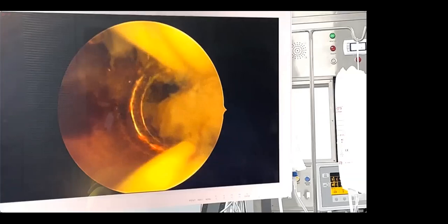And the other thing is there are bags that you actually put under the patient's buttocks, which collect all the fluid and give you a measurement, with graduations on them. These companies make bags that tell you how much fluid.